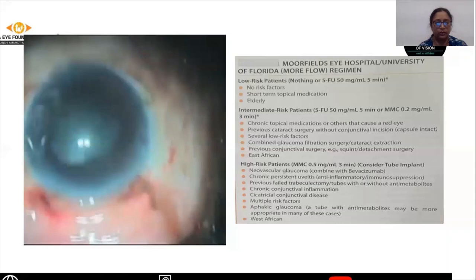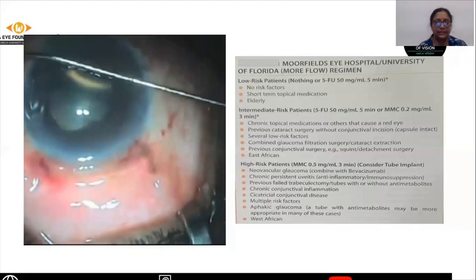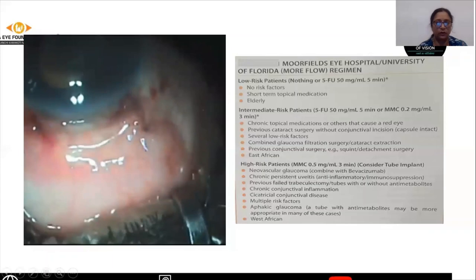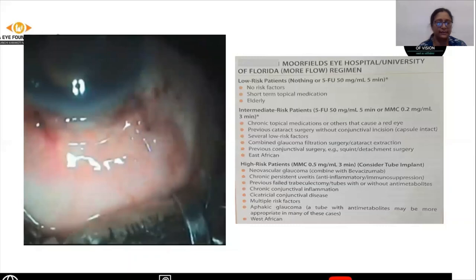Once that is done, you need to form the bleb and check for the patency of the ostium and the extent of the bleb which is formed. This is how a well-formed bleb looks on the table immediately after surgery. You can see that it is an extensive and well-formed bleb. Thank you.